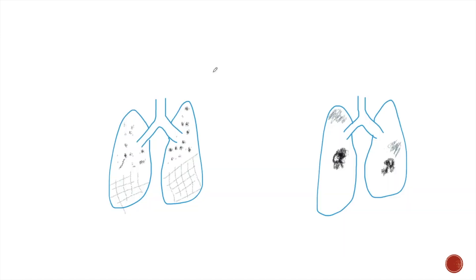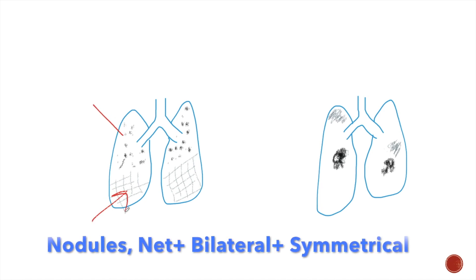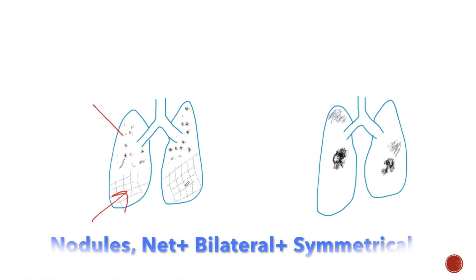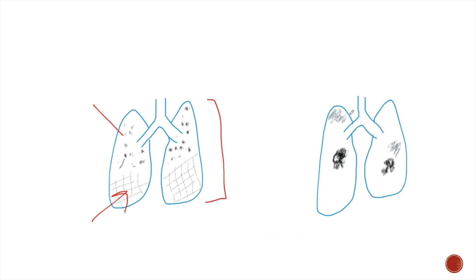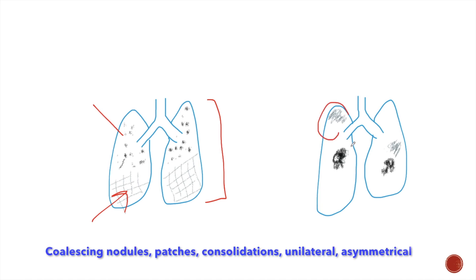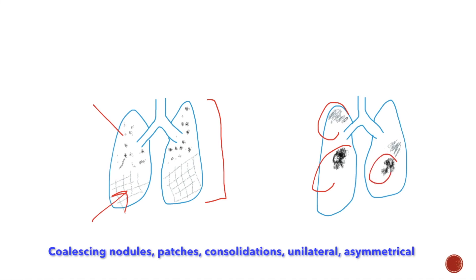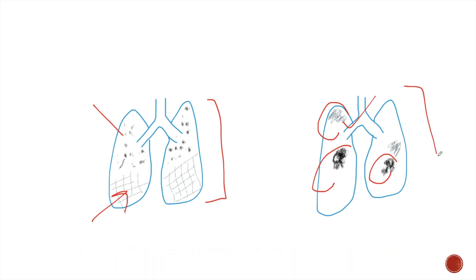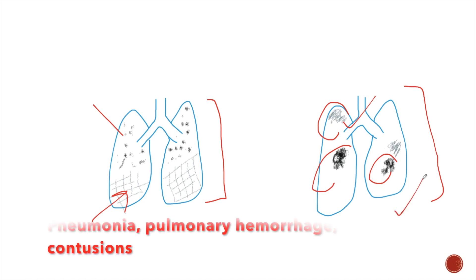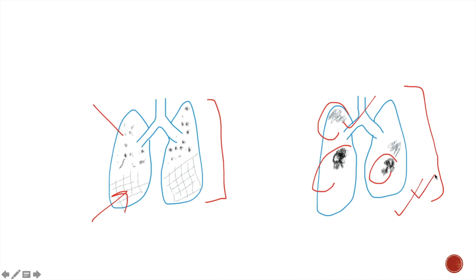These two images sum up what you have learned from this video. Interstitial opacities present with nodules or net-like opacities which are discrete, bilateral, and more or less symmetrical — seen in interstitial lung disease. Alveolar opacities, on the other hand, present with patches and consolidations or coalescing nodules, which are more commonly unilateral but may also be bilateral and are usually asymmetrical — seen in pneumonia, pulmonary hemorrhage, and other diseases that affect the alveoli. Thank you.